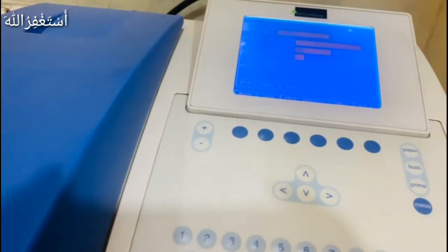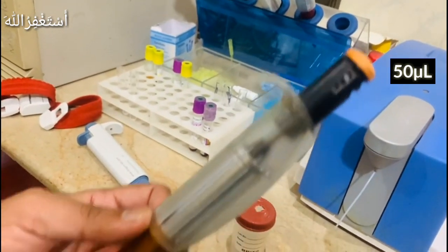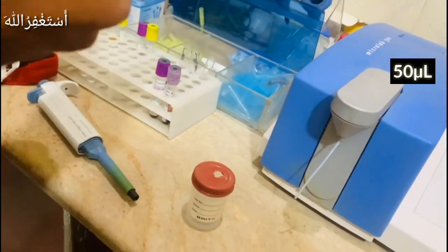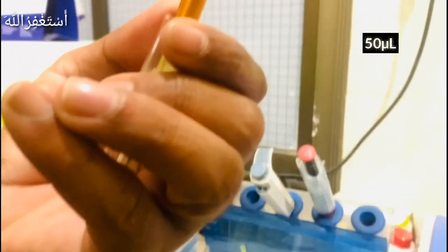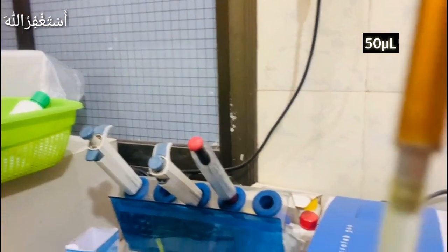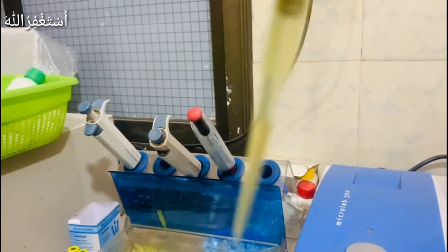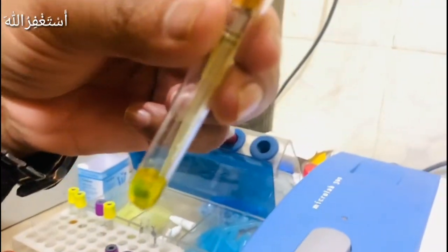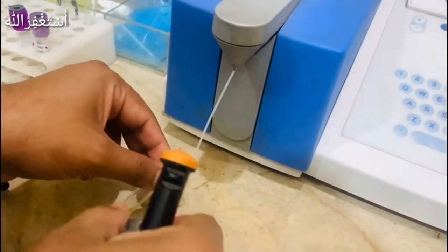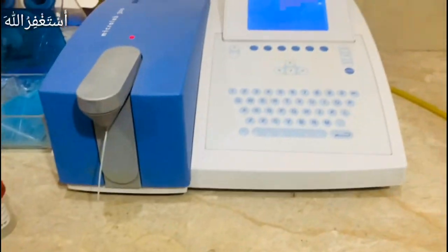We have set up the sample. We have taken a patient serum — 50 microliters — and we will put it into the machine. Now we have placed it inside and it will automatically load. When the light comes on, it will move it to the reading position. You can see that this is now measuring.